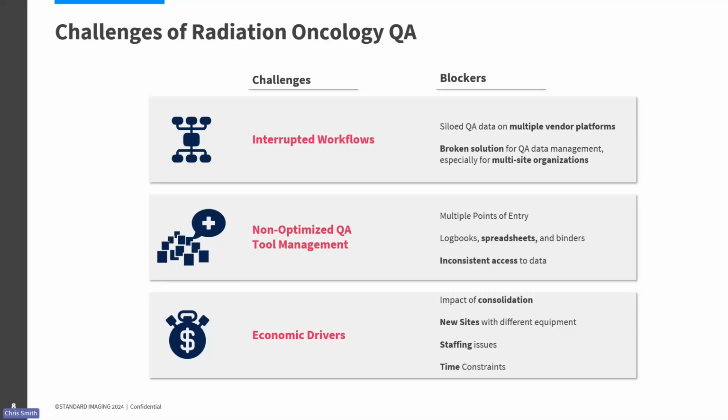I think one of the bigger challenges is that QA and RadOnc specifically have a habit of tracking these things in spreadsheets, where human error is a really prevalent part of your daily QA device management. Also, with any new daily, monthly, or annual machine QA product that you would bring in house, all those setups and lots of hands touching those things, right? So QA and RadOnc is specifically subject to these data inconsistencies.